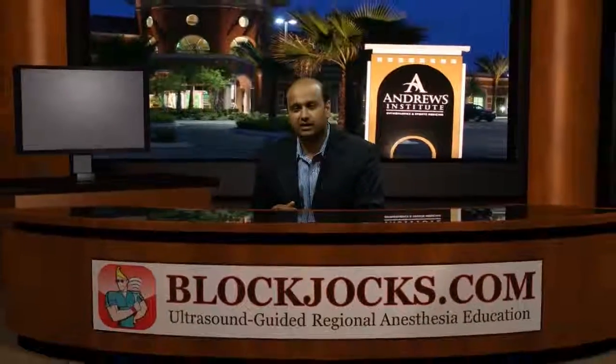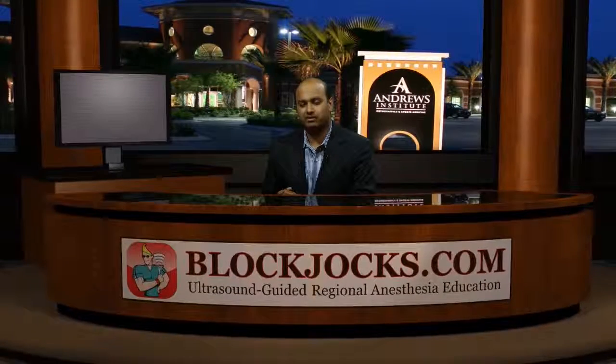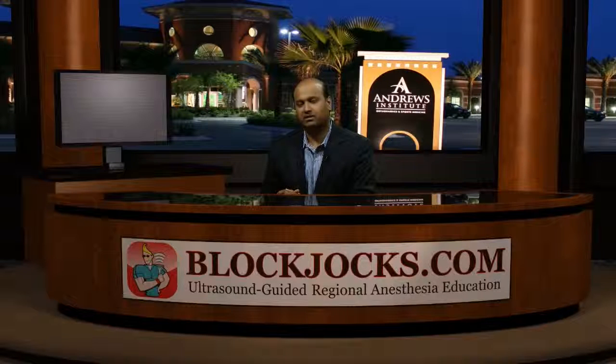So in closing, I think ultrasound can be a very useful technique in chronic pain conditions and often can be combined with fluoroscopy or CT guidance to enhance the ability to visualize soft tissue structures, to visualize the spread of the injectate, and provide an alternative method when fluoroscopy and CT are not available.